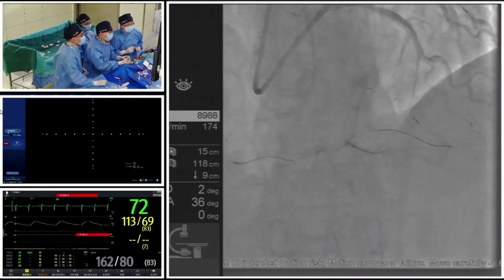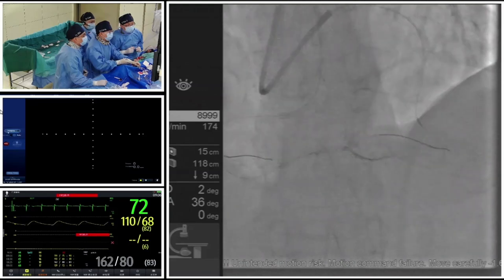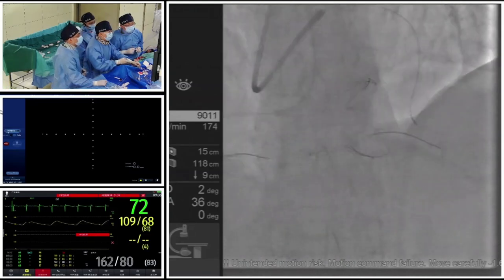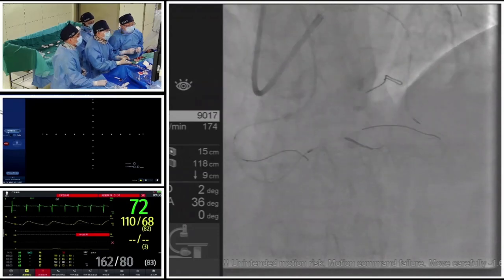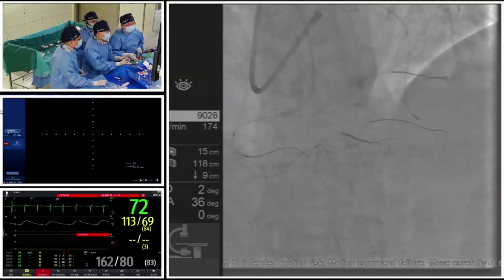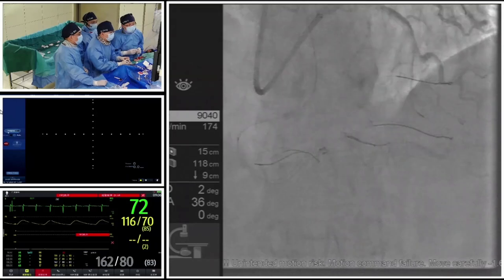The second thing is that the sutures are bioabsorbable. So after follow-up, they can be fully absorbed by the human body, and do not leave anything that causes a distal problem. So I think this is a good technique. This is for septal perforation or septal branch perforation.